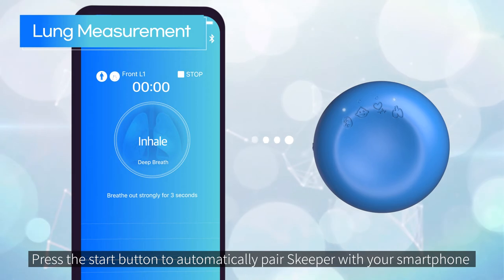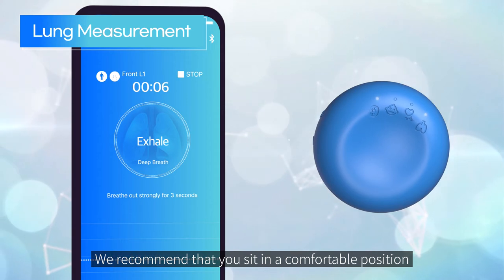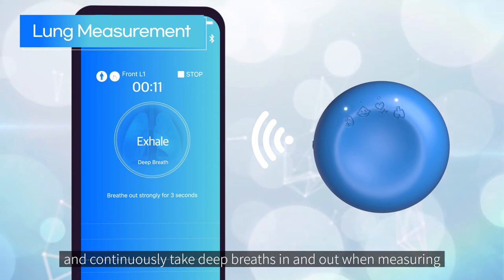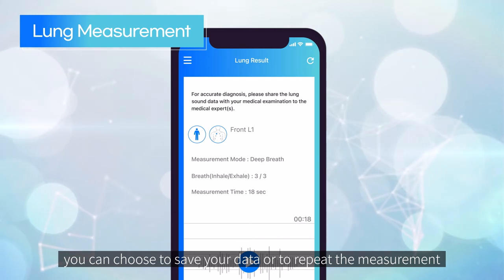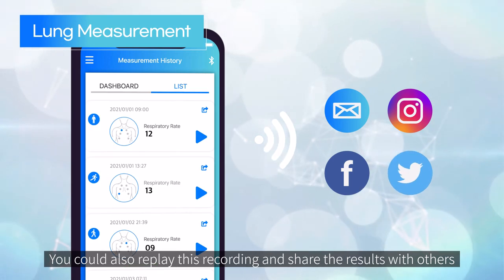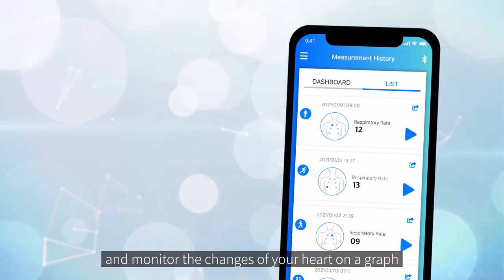For lung measurement, press the start button to automatically pair Skipper with your smartphone and to start the measurement. We recommend that you sit in a comfortable position and continuously take deep breaths in and out when measuring. After the measurement, you can choose to save your data or to repeat the measurement. You can also replay this recording and share the results with others.